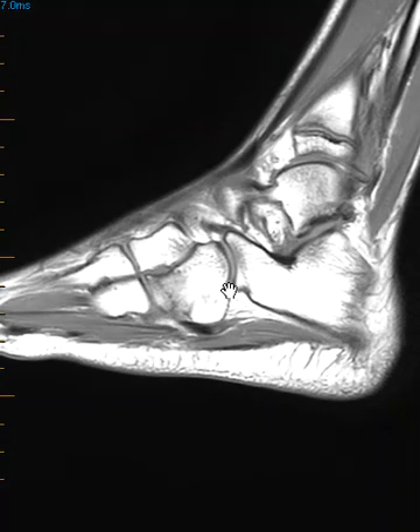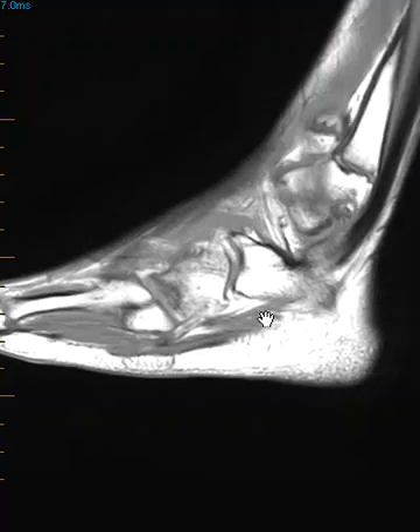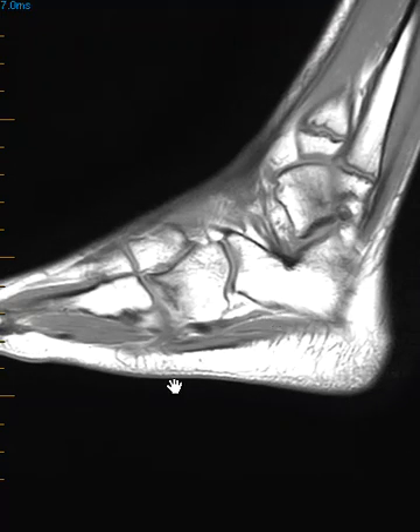Rather than continuing on with sports and just dialing back, they're going to treat her much more aggressively to let this heal. This just shows you that x-ray is excellent for displaced fractures, but if they're not displaced or the view doesn't look at the fracture just right, they can be easily missed — and MRI can show them pretty easily. That's it, thank you very much.